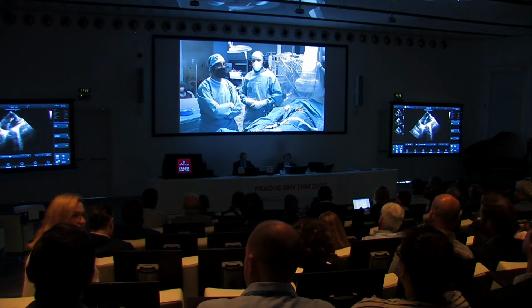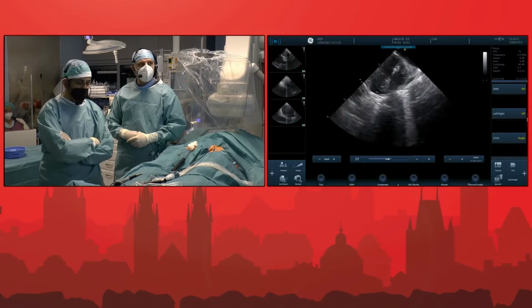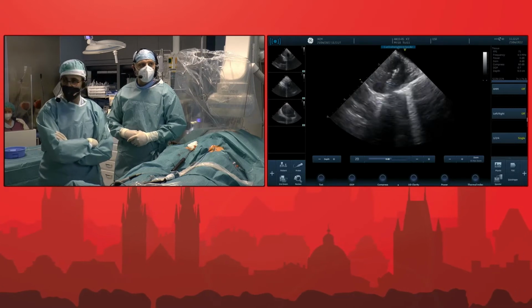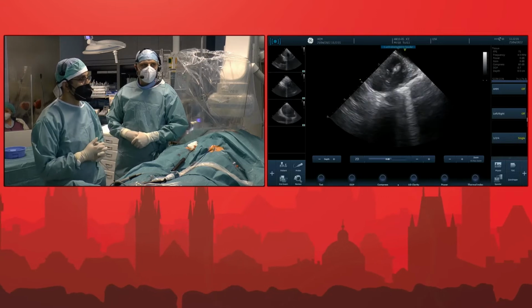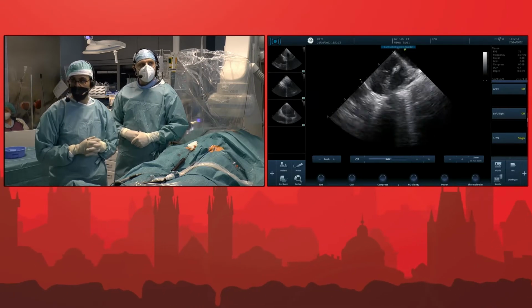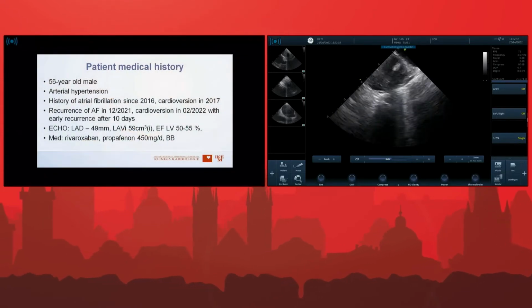Okay, hello, this is IKEM EP Lab number 3, and we are about to present you an ablation of persistent atrial fibrillation. A little bit something maybe different from yesterday, using the Afera system. Can we switch to the review screen for me to introduce the patient?